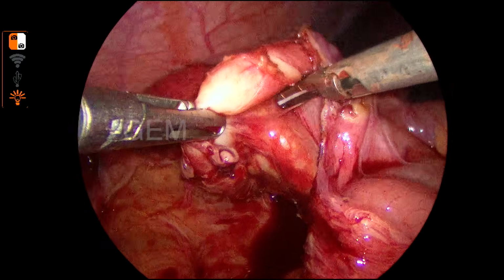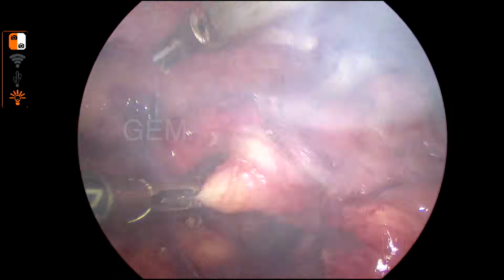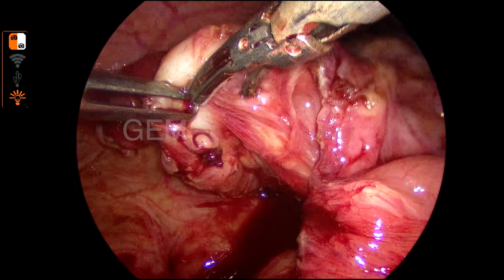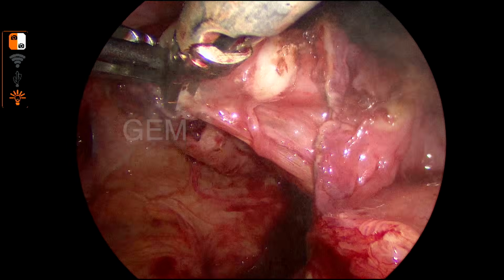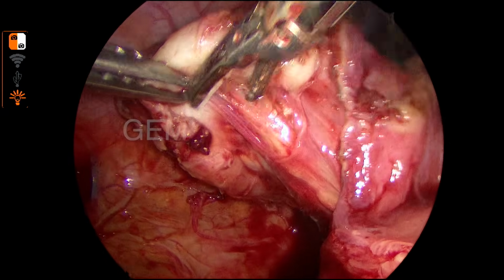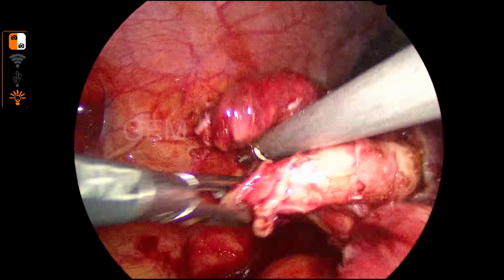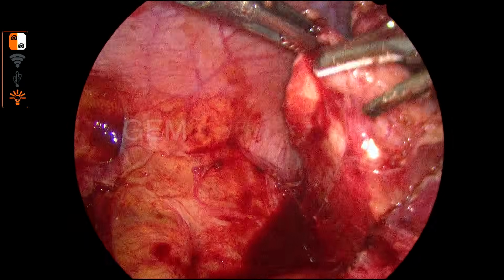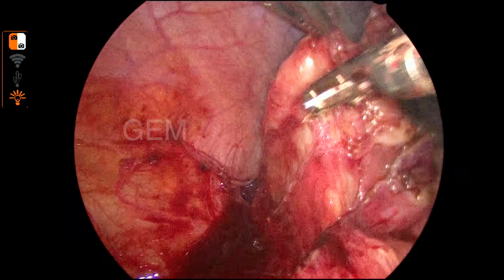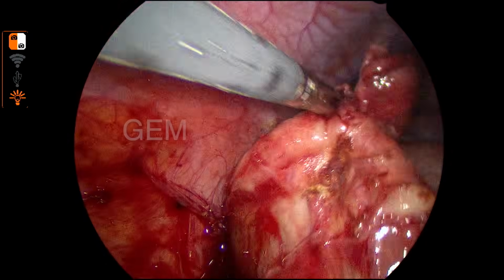So now I am dividing the mesoappendix. See, I am dividing the mesoappendix. So once you divide the mesoappendix, we have a plane. We can see the other side.